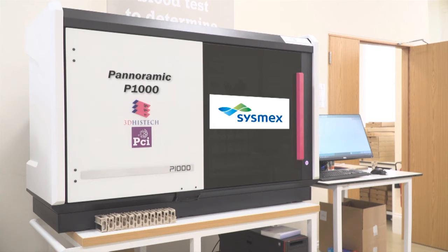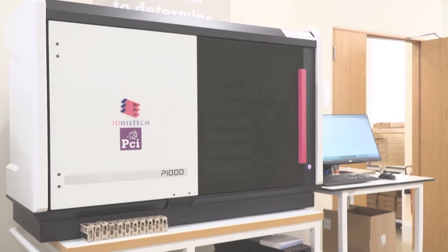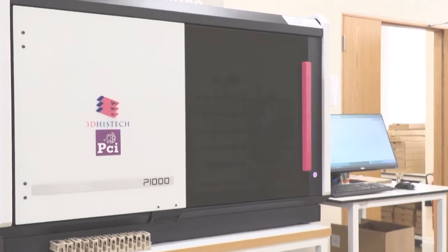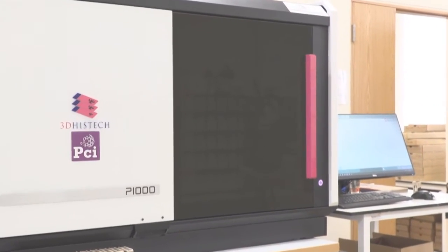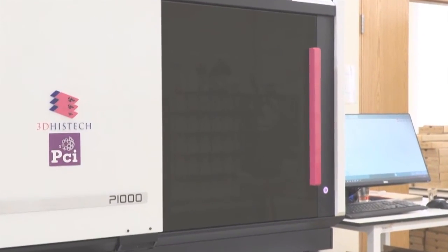This is a presentation about the Panoramic P-1000 from 3DHISTECH, filmed at Poundbury Cancer Institute.